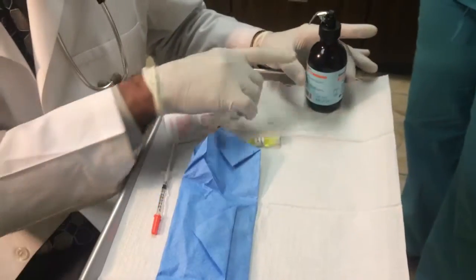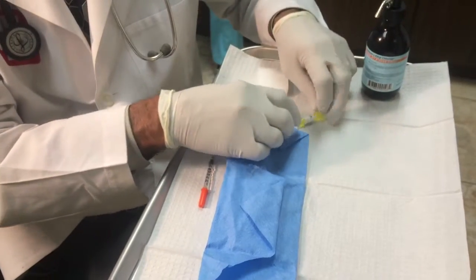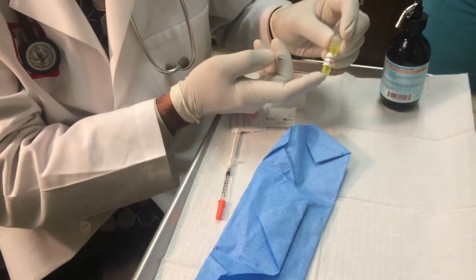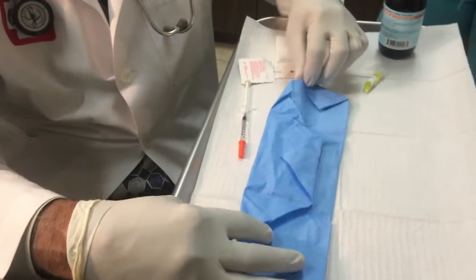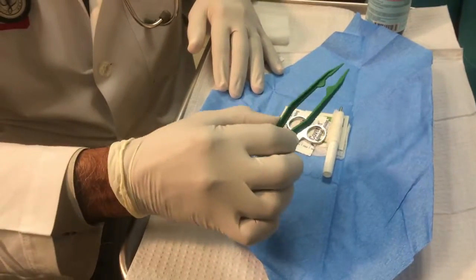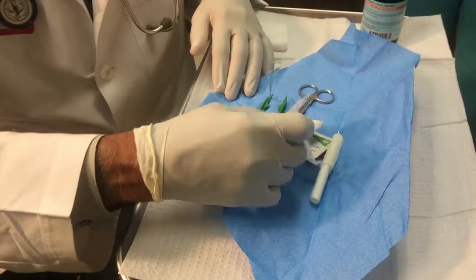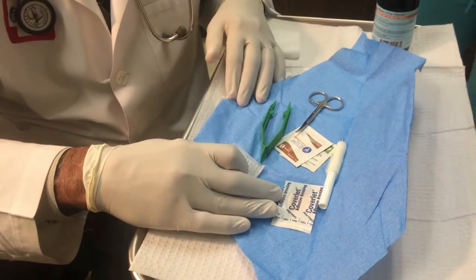So first let's focus on this. We have a kit. I have a local or topical anesthesia — ethyl chloride for numbing the superficial layer. I have a preservative which came along with the kit and it is to transport the specimen. We have this small blue kit. Opening it, it has a punch biopsy tool, a small forcep, and a scissor to cut the pedicle of the specimen.